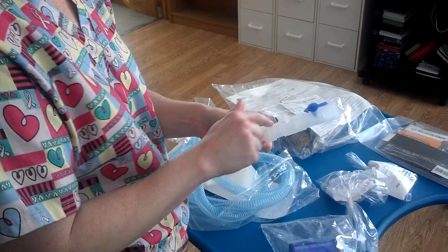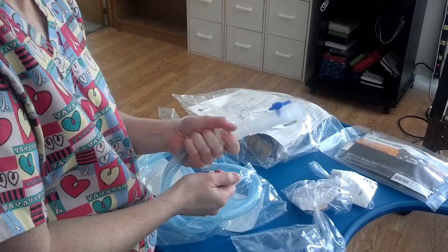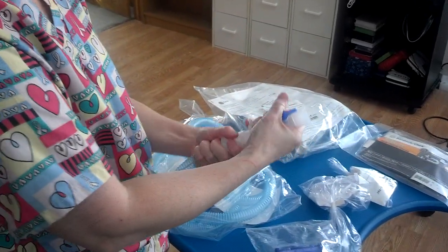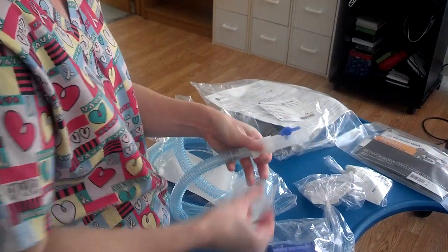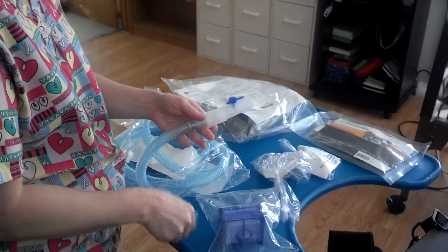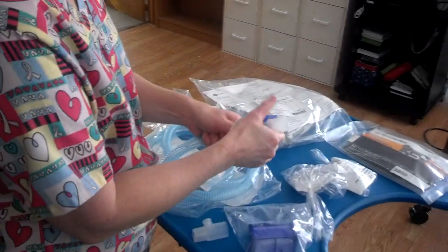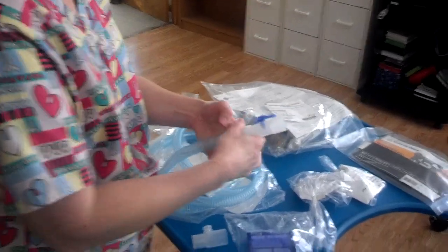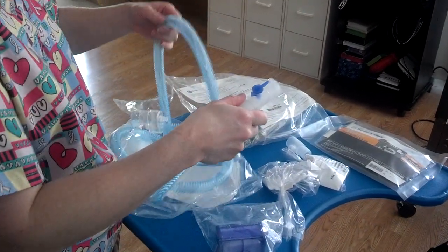Making sure everything's closed and tight. Since we don't have the humidifier, we don't need that — it's just an extra piece. Extra pieces in ventilator tubing is known as dead space, which in essence reduces your pressure. So whatever you can get rid of, that would be good.